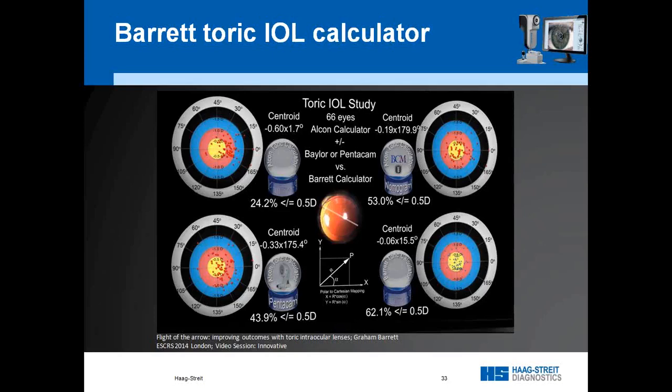Now you might wonder, why is a fixed number used to adjust for the posterior cornea better than the measurements done by the Pentacam? I don't know the real answer, but I can only assume one. If you look at topographers, we all know that they are perfectly good imaging devices. They provide very valuable information on the corneal topography. So we see if we have local dents, steepening, keratoconus, or irregularities.